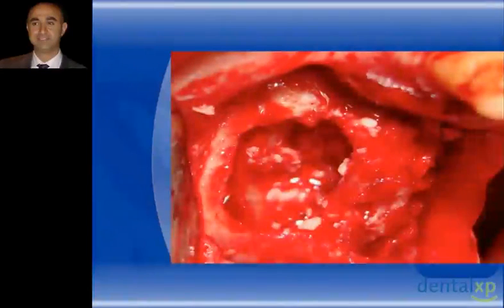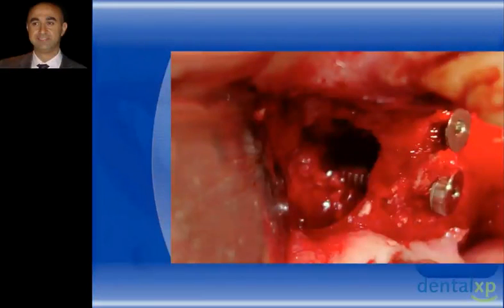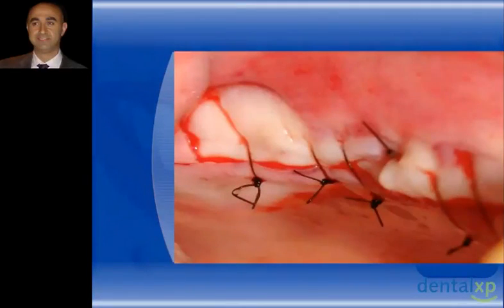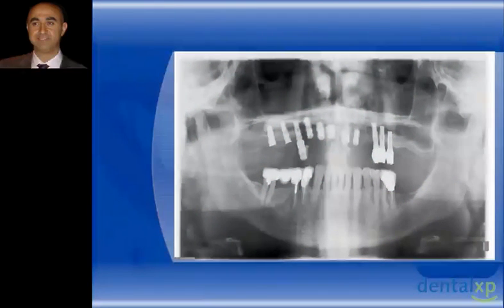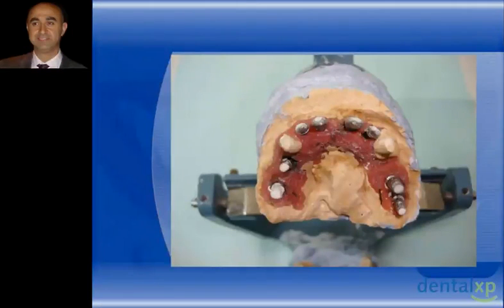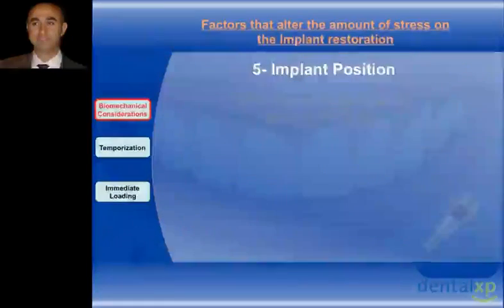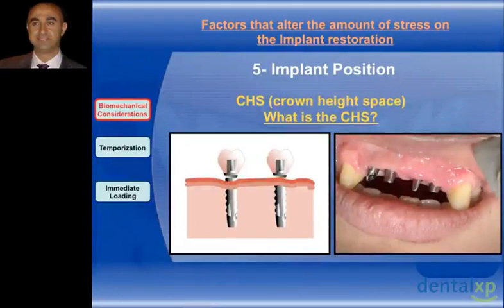As you can see, just showing that again, complications, if handled in a proper scientifically based manner, can be overcome. But if the treatment plan of your implant restoration to function future-wise under normal occlusal loading is not properly planned, you will get failures of everything that you have succeeded from the beginning. So again, other cases, just showing that after placing the implants, placing more implants, connecting all the implants together in a curvilinear arrangement. As you can see, every 3 implants are creating an offset implant to counteract any lateral forces, as we said before, and the end product, you have a successful long-term implant restoration.